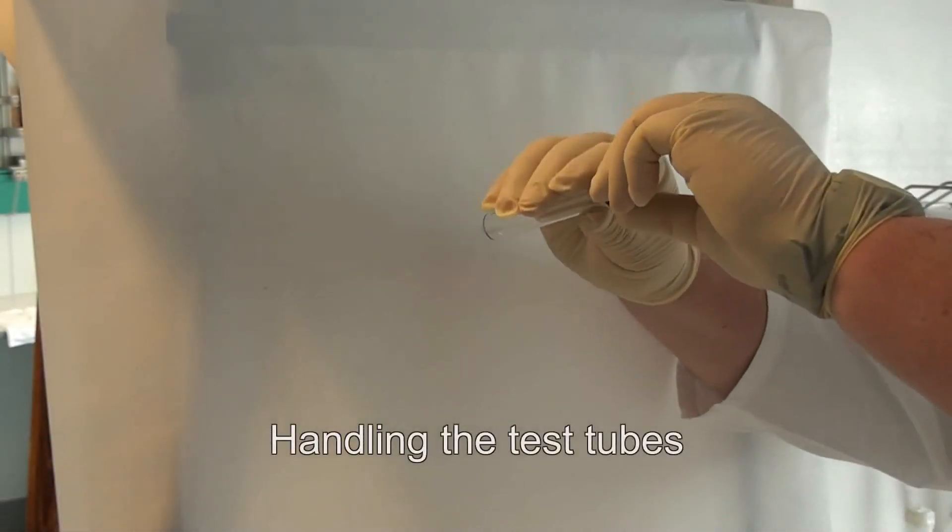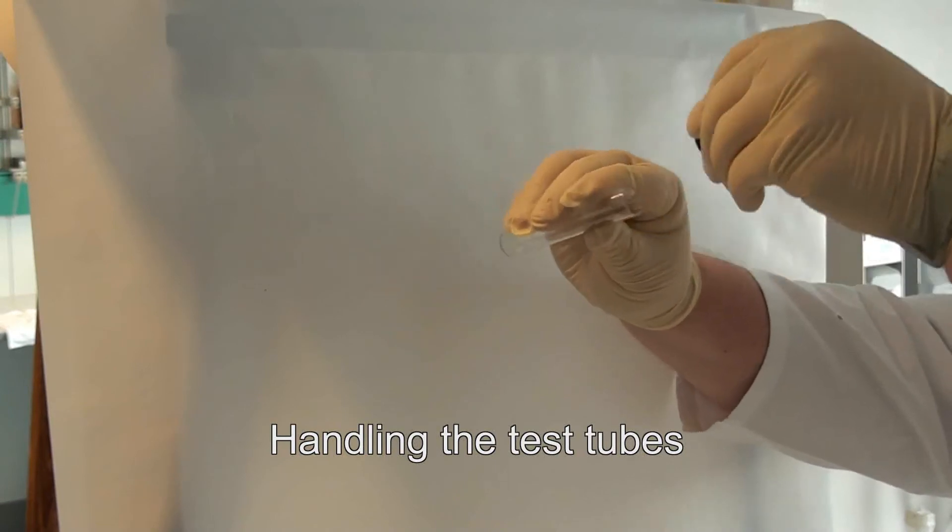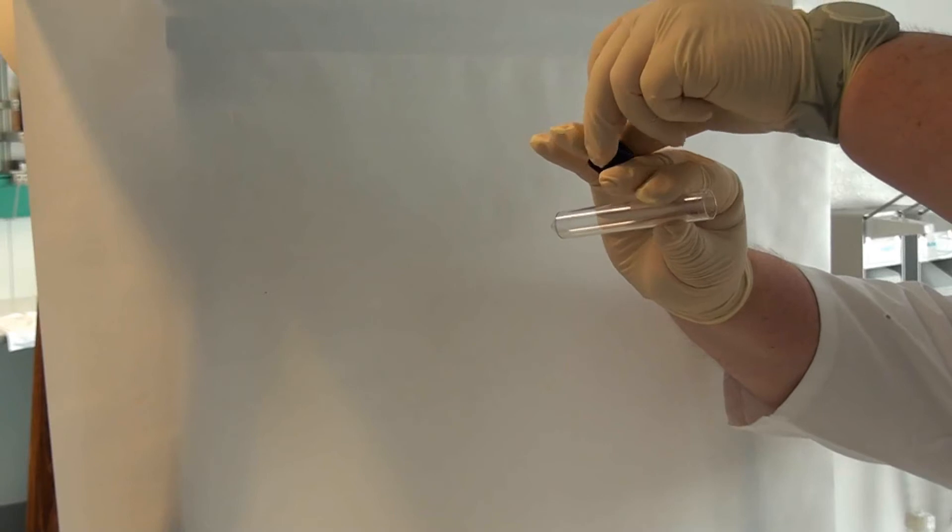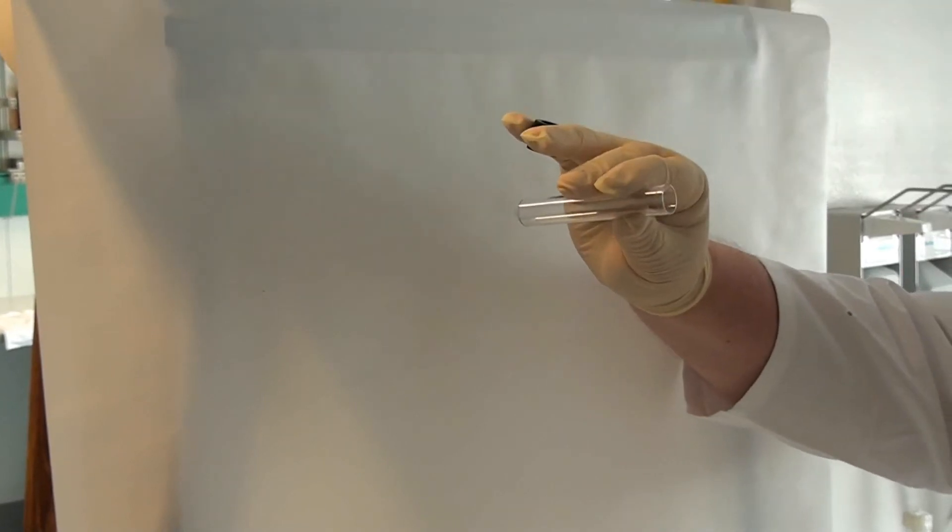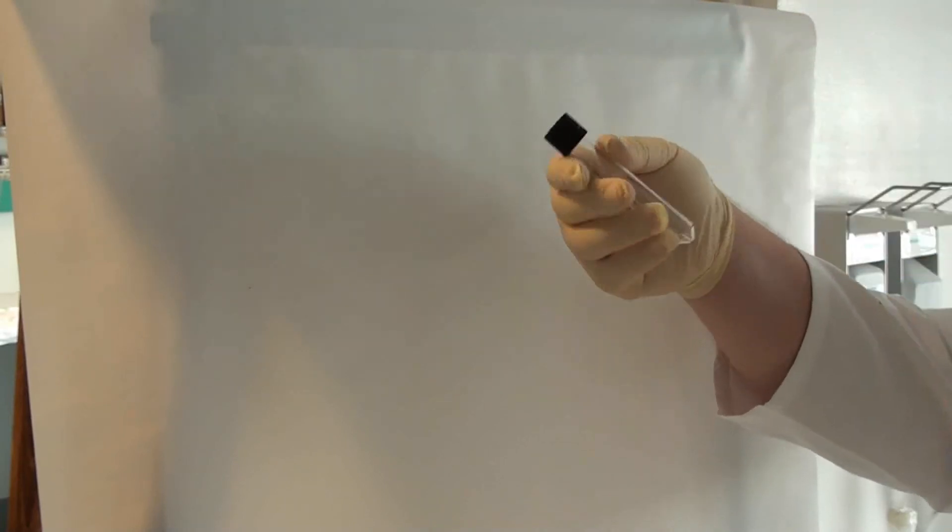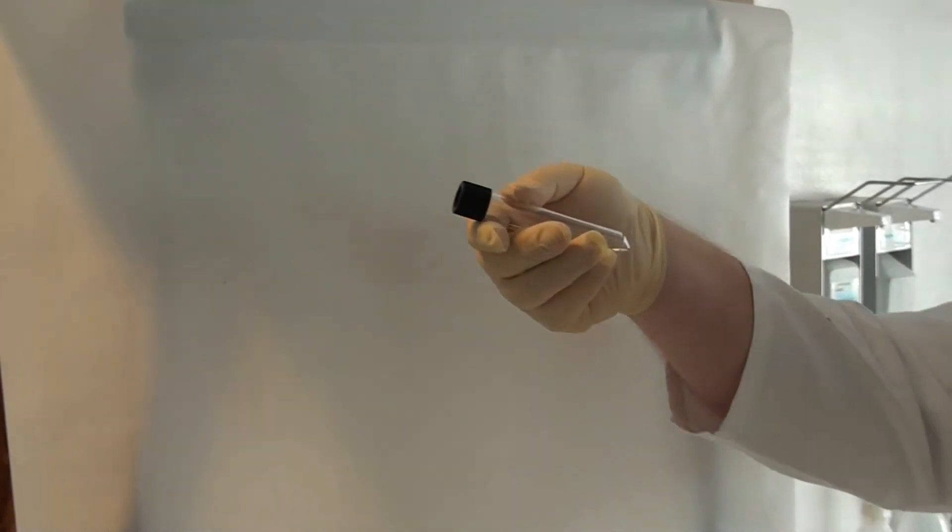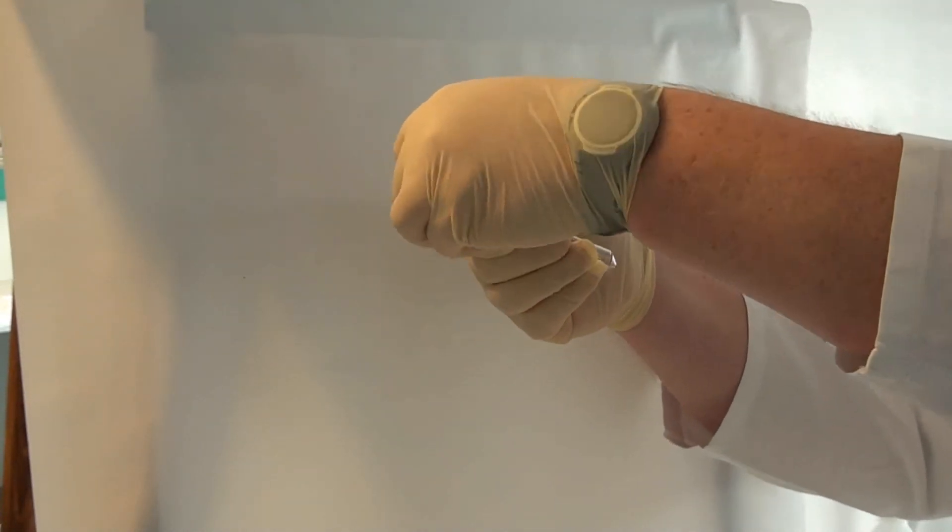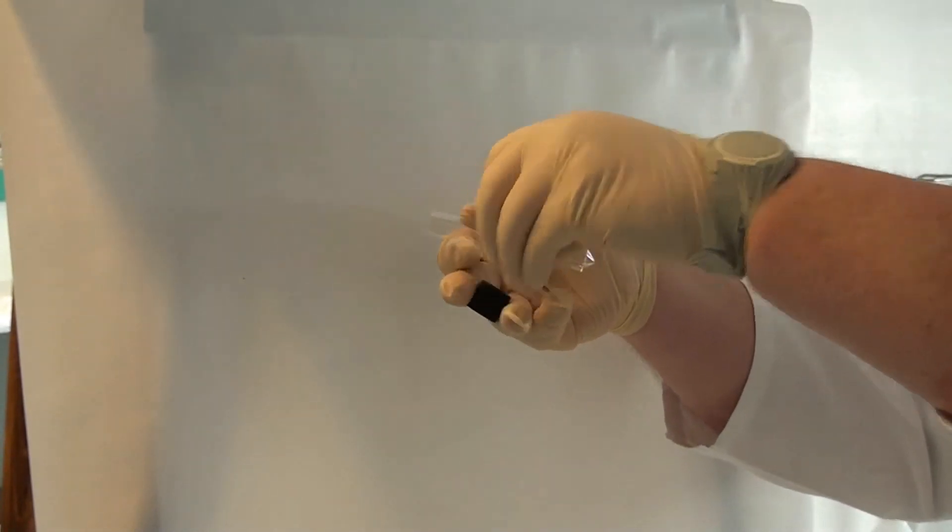Sterile test tubes have to be handled with care. As dirt may trickle from the udder, tubes should be kept in a horizontal position most of the time, and the plug should be protected with your hand either like this, or like that, having the plug pointing downwards.